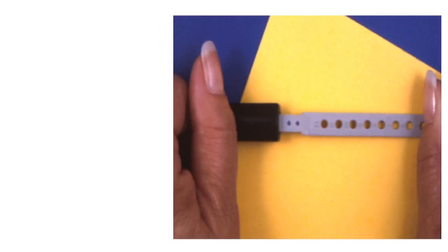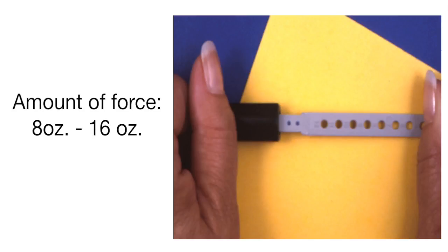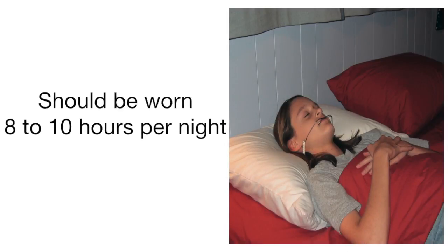This shows how the neck strap is adjusted. The initial amount of force you use is 8 ounces up to 16 ounces. It is important that the face bow be worn properly and for the right amount of time. It should be worn a total of 8 to 10 hours per night, and should be worn one hour before bed and then all night.